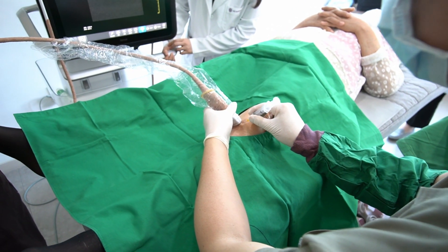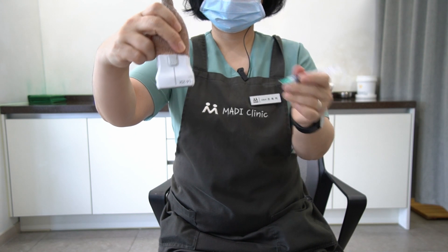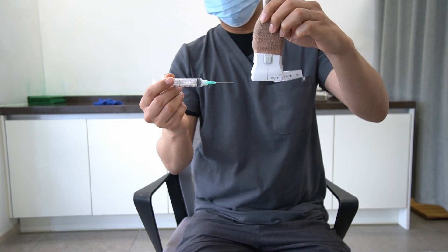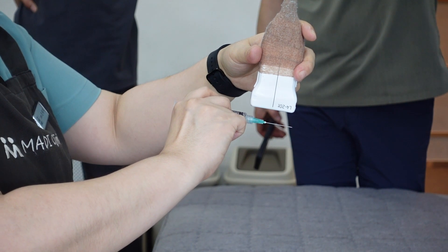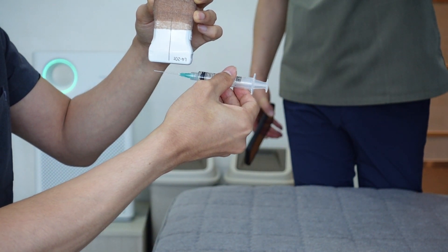Which of these insertion approaches is considered the easiest or most challenging? The options are: holding the needle with the left hand and the probe with the right hand, moving horizontally from left to right; holding the needle with the right hand and the probe with the left hand, moving horizontally from right to left; holding the probe with the left hand and the needle with the right hand, vertically moving away from your front to the opposite side; or holding the probe with the left hand and the needle with the right hand, vertically moving from the opposite side towards your front.